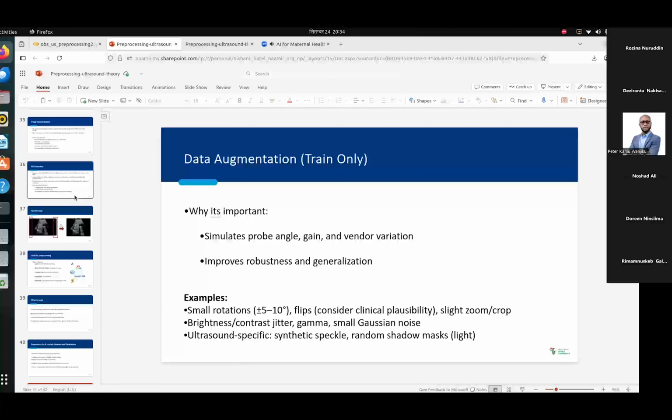The question that is being asked is, when this model is finally accurate, 90 something percent accurate, 99% accurate, and you put it in the field, will the fact that you used pre-processed and processed data to train it limit its ability when now a nurse in a rural center goes to use the blind sweep and the model is automatically meant to? So basically, they're asking for you to explain whether it will have any implications.